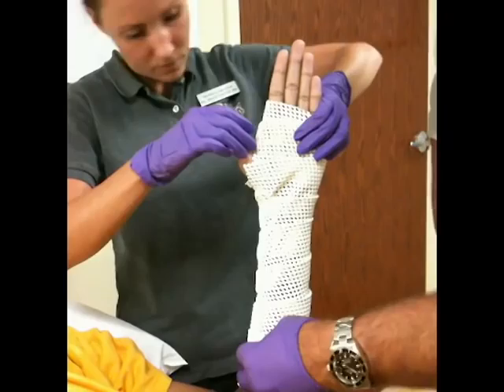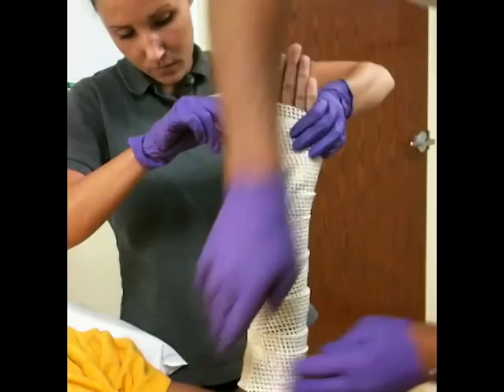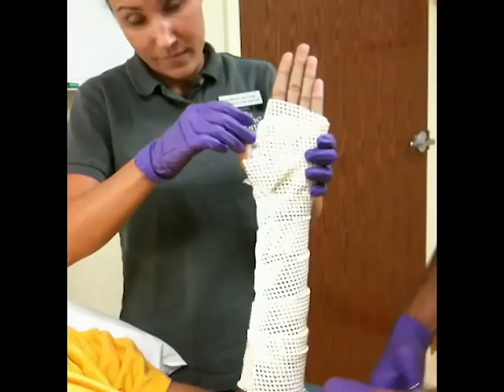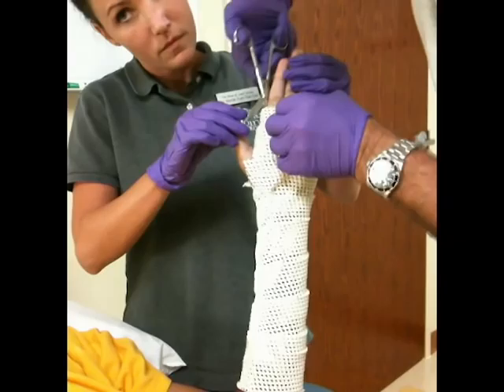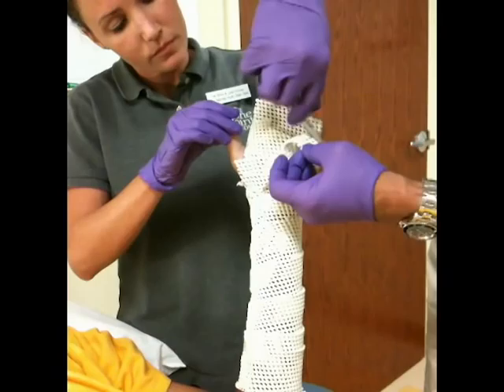A small piece of tape is applied to hold the material in position, and cuts are made at the bottom to allow the hand to be folded up. The cut is made along the side of the small finger and the index finger, and excessive material is removed.